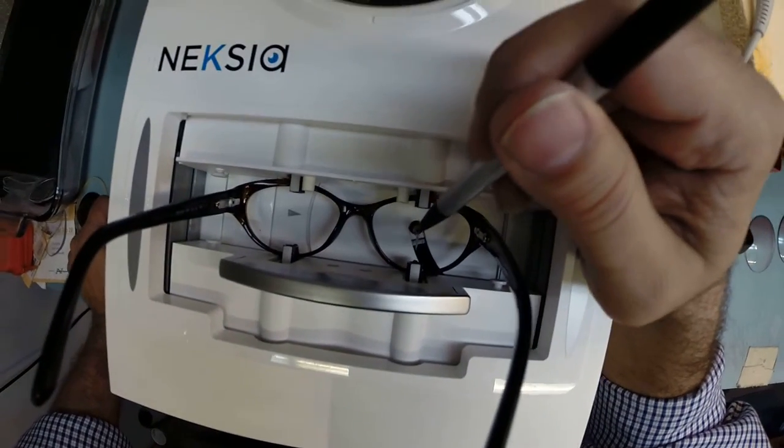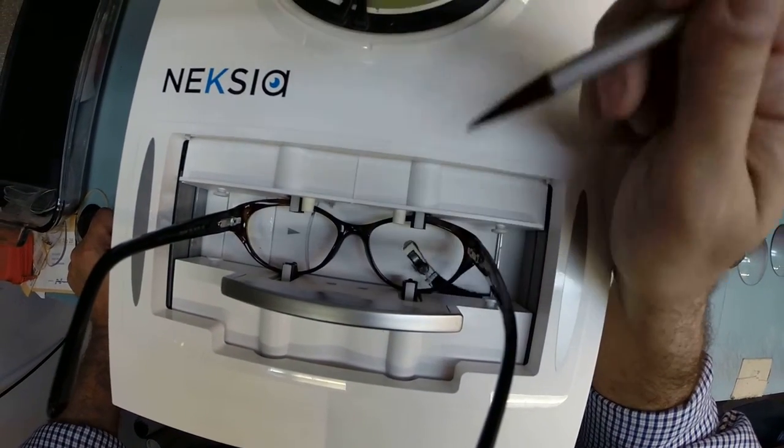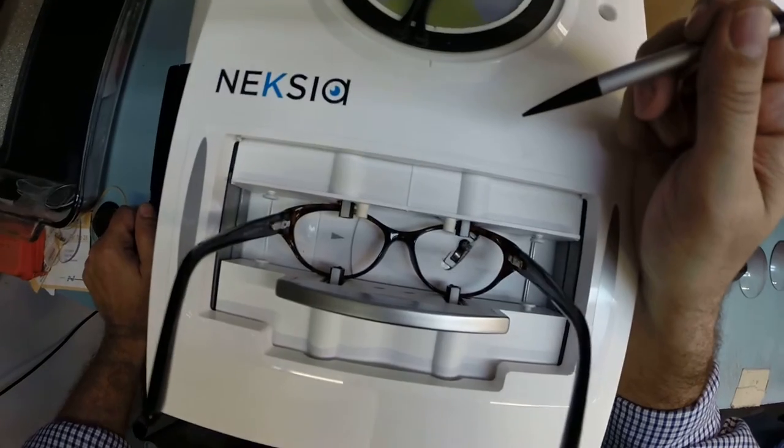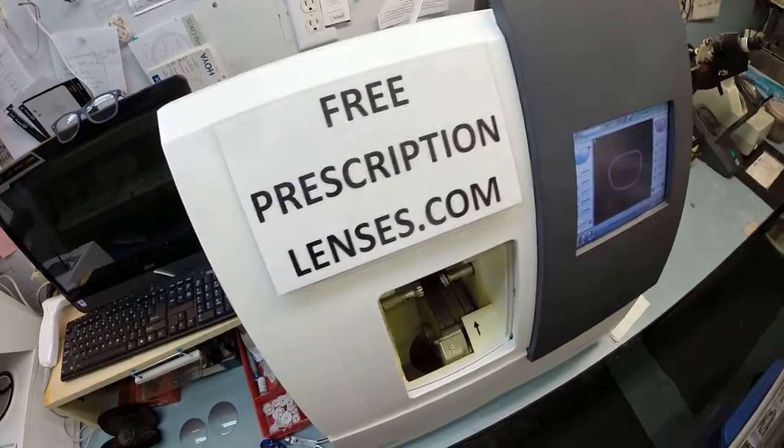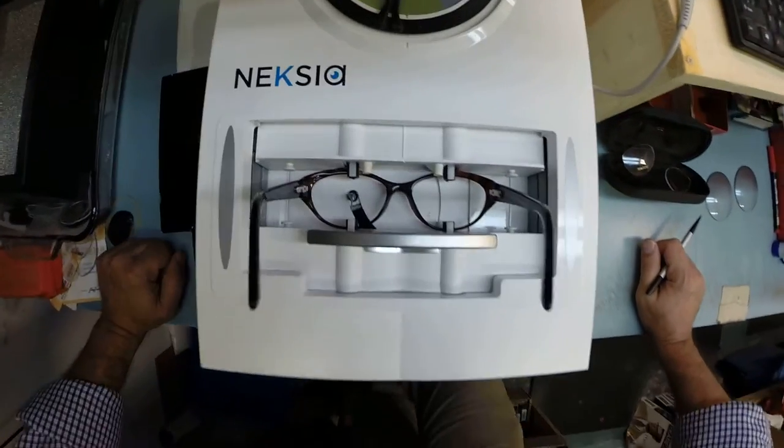I'm going to take your frame, put it into the tracing element of my edger, and hit trace. The clamps close, and then this little stylus is going to pop up and trace the shape of the right lens before moving over and tracing the shape of the left.